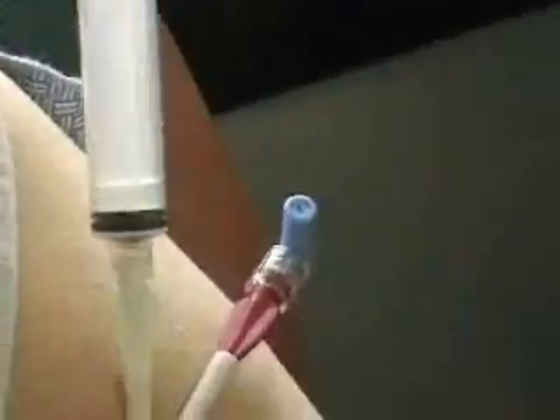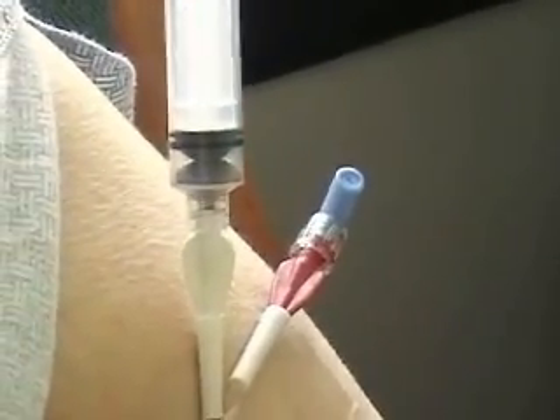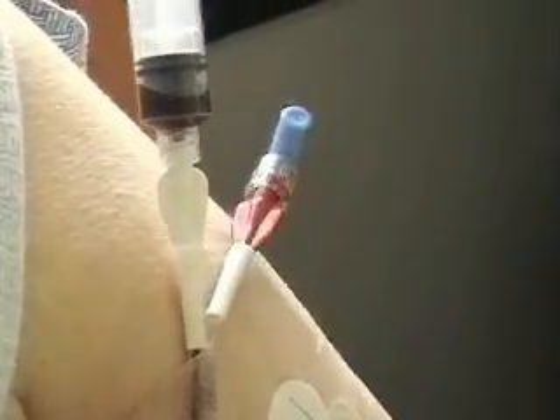Then we'll draw our sample. She said we only need about three or four cc's for the sample. Hopefully we can get that this time.